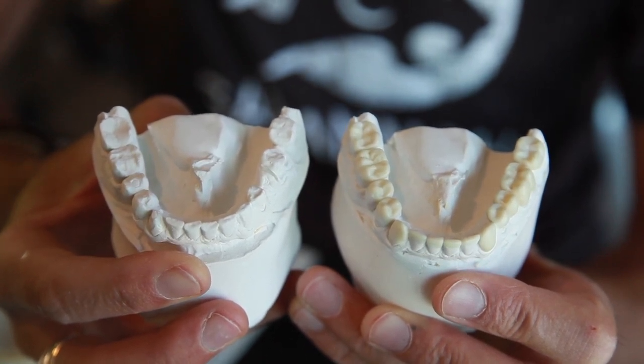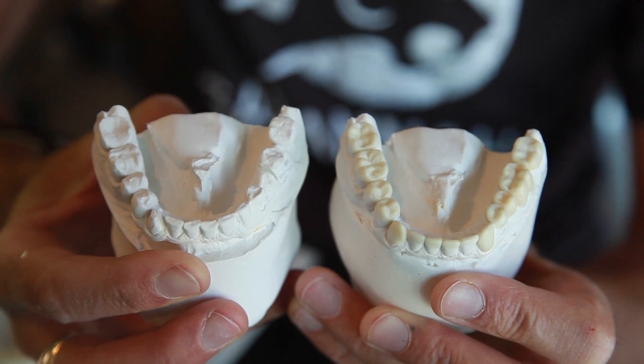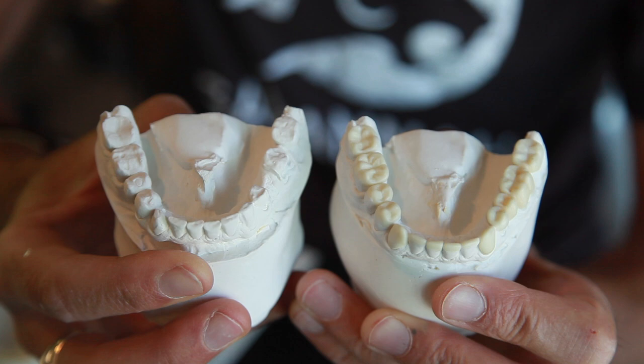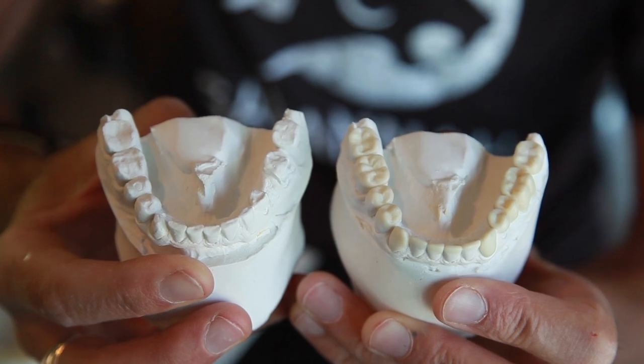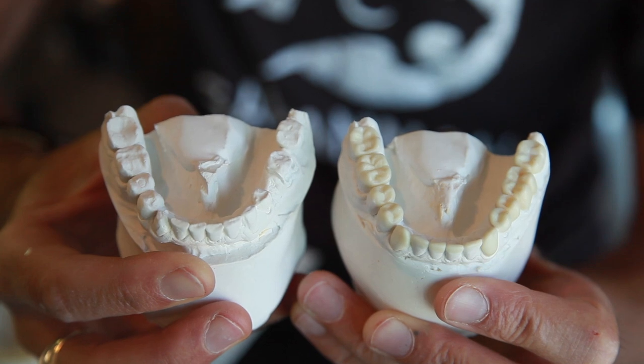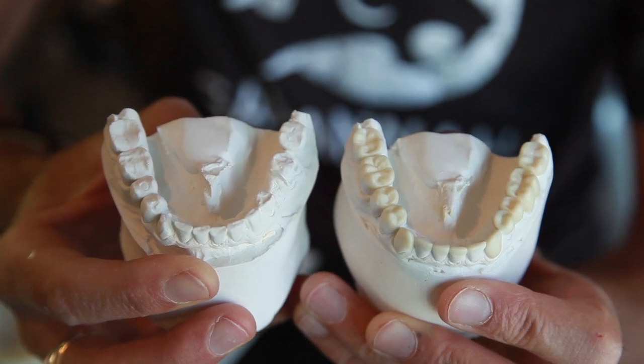What we did here is a wax-up — we have restored vertical dimension, but we'll be going back probably in a year or two to do the final touch-up. Right now we want to get him aesthetically looking better and give him some form to be able to chew his food.